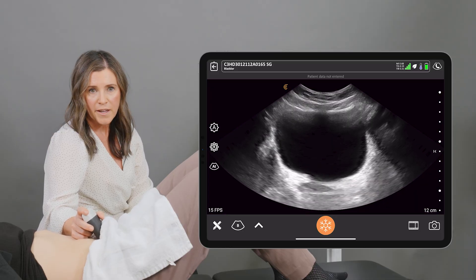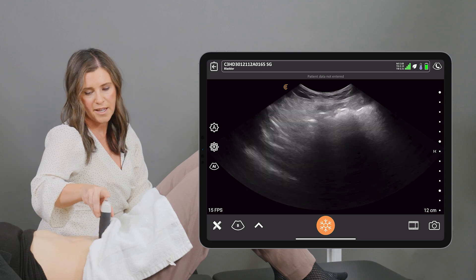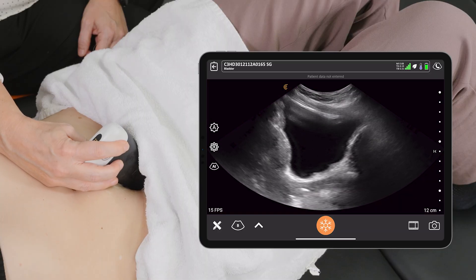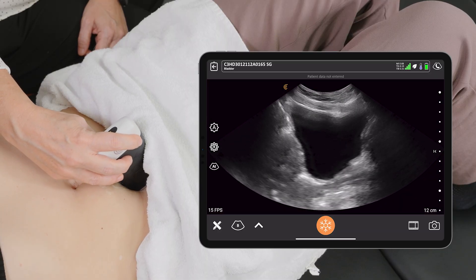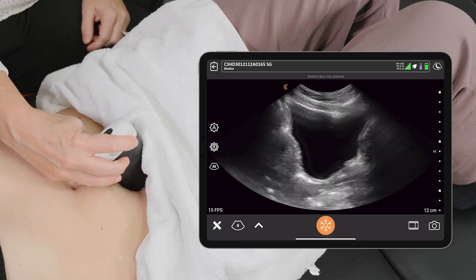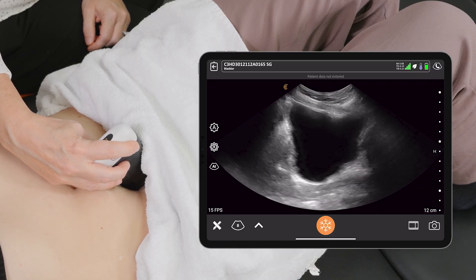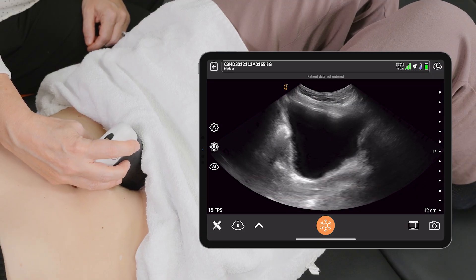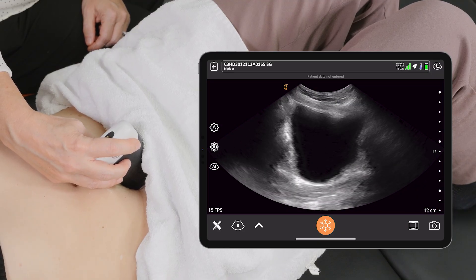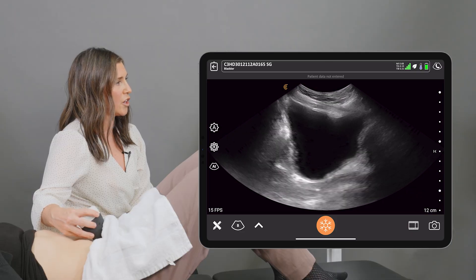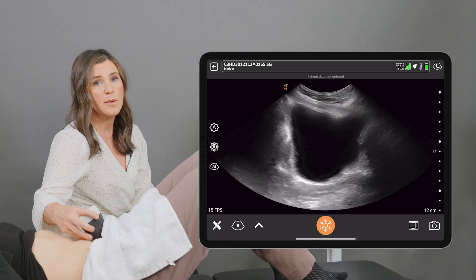From there I'm going to orient the probe to the sagittal plane, taking the marker up towards the client's head and angling the probe down even further. In this position, the urethra is off to the right side of the screen. We'll get the client to contract their pelvic floor and let that go, observing the elevation of the bladder base and then its descent back down. That wraps up the transverse and sagittal views for transabdominal pelvic floor assessment.